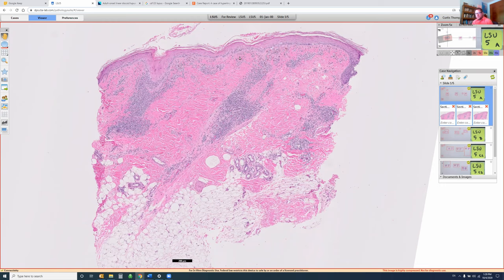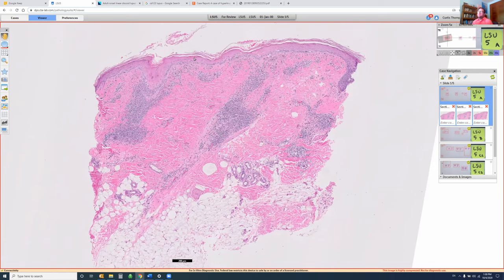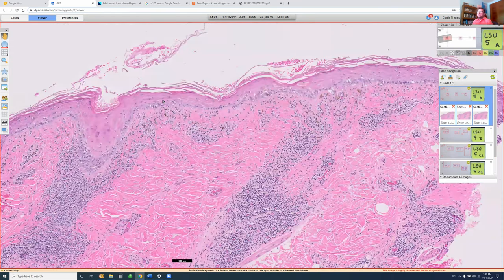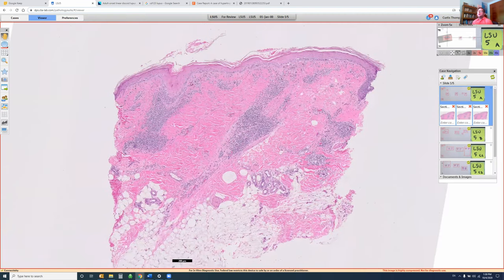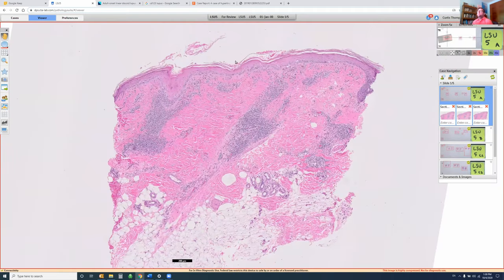We like to talk about top-heavy versus bottom-heavy infiltrates — more lymphocytes down deep suggests lymphoma more. This is a top-heavy infiltrate. Lymphoma doesn't cause an interface like this as much, and this isn't the pattern of mycosis fungoides, which is psoriasiform. So we have superficial and deep, chronic interface, melanophages, and the perifollicular pattern, which is really good for lupus. Lupus loves the follicles.